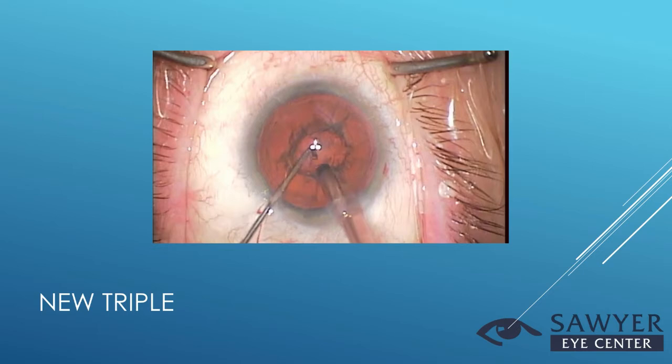I'm marking the cornea at 8 millimeters, and now I'm scoring the corneal endothelium and Descemet's, and then we're going to just strip out Descemet's membrane and the endothelium, leaving all of the rest of the stroma behind, all the structure. Removing the viscoelastic, putting in a little Miochol or Miostat to bring the pupil down.